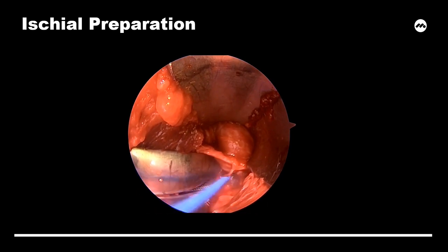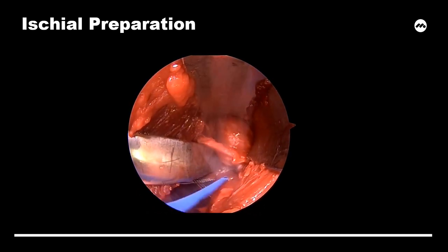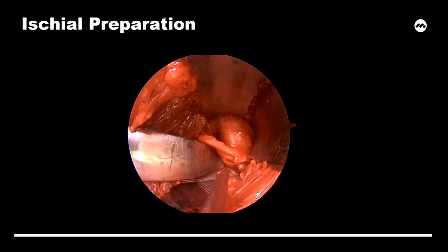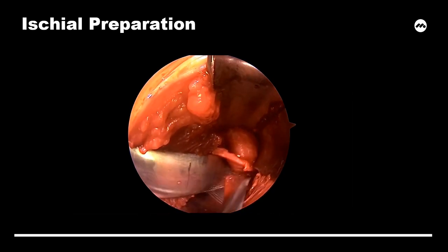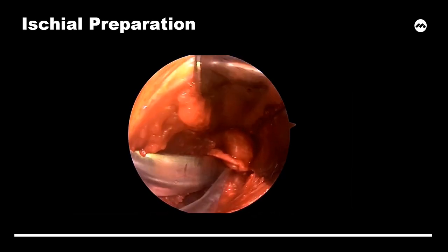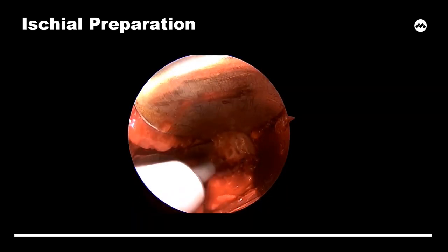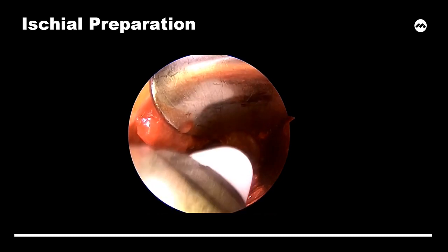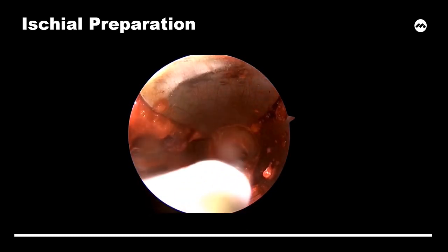For improved visualization for this video, we demonstrate the ischial-sided work using a camera. Cautery is used to mobilize soft tissue off the bony base. The bony surface is then prepared with elevators and a high-speed burr. Throughout this time, the tendon is mobilized away from the surgical field and the sciatic nerve is protected laterally by a blunt retractor placed in the lateral ischial border.